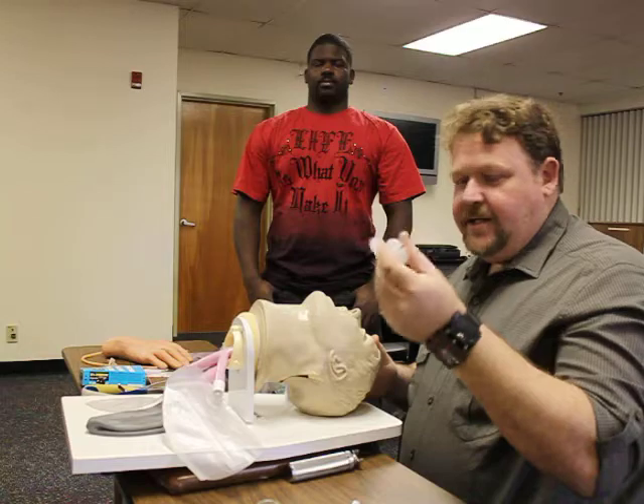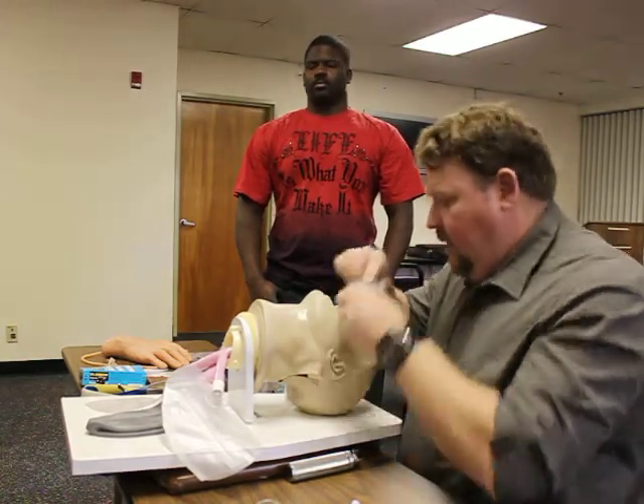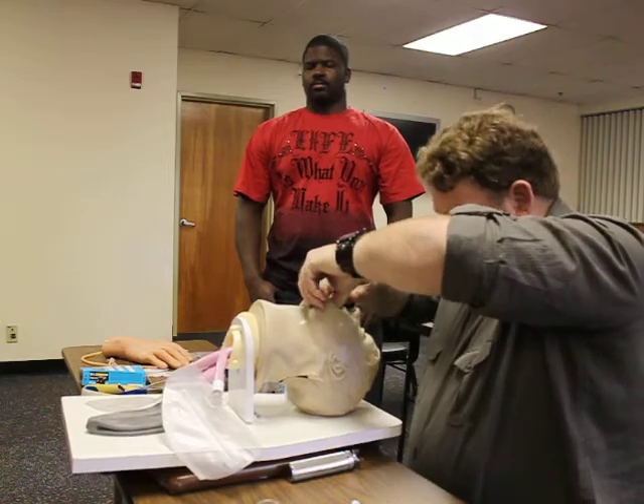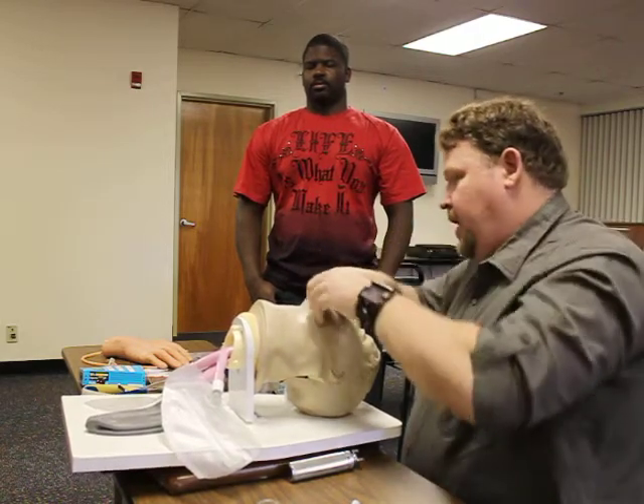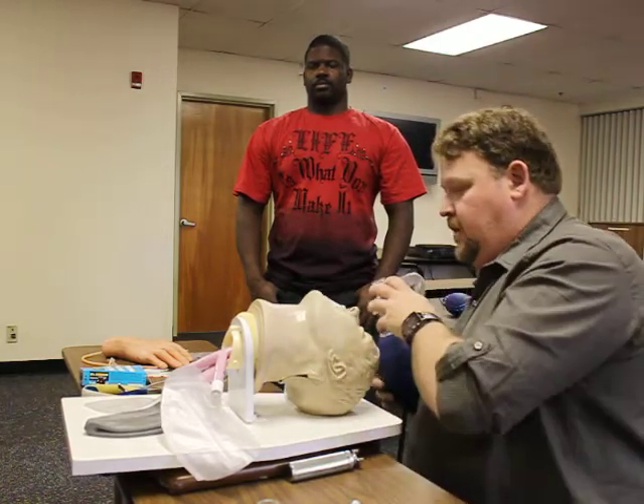I'm going to go ahead and select my oropharyngeal airway. I'll measure off from the corner of the mouth down to the earlobe. I'm going to insert at a 90-degree angle, sweeping the tongue out of the way. The patient accepts the adjunct and has no gag reflex.